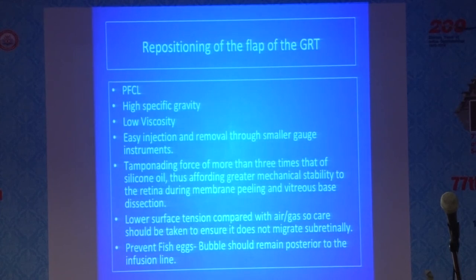But we also have to remember that it has lower surface tension compared to air or gas. So care should be taken to ensure that it does not migrate subretinally, because that is what can happen. And then there is also an incidence of fish eggs, because the PFCL bubble breaks into multiple small bubbles. For that, the PFCL bubble should be injected slowly, and it should remain posterior to the infusion line.